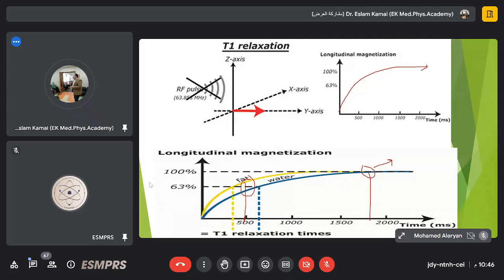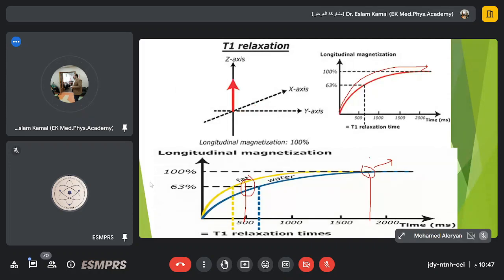So how can the coil, or our machine, differentiate between the signal induced by MZ and the signal induced by MXY? Do you have an answer for this question? The coil has multi-channel, so not one channel. Each channel is listening for a certain frequency.